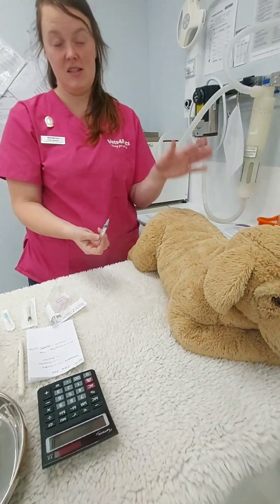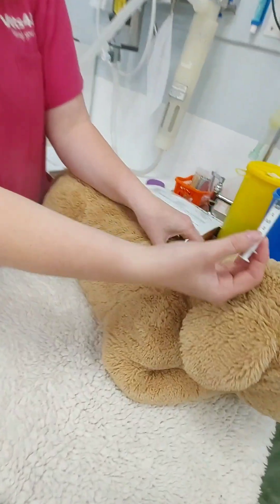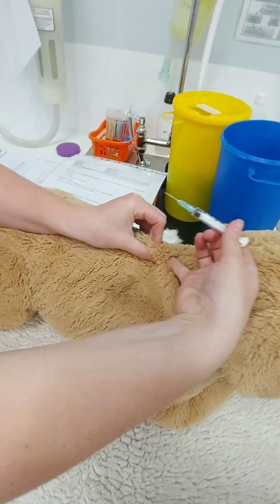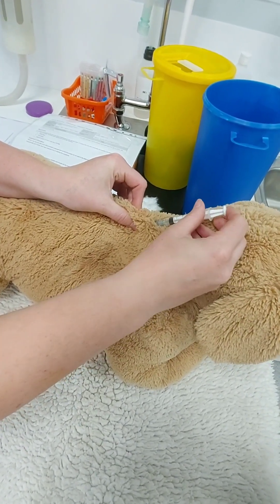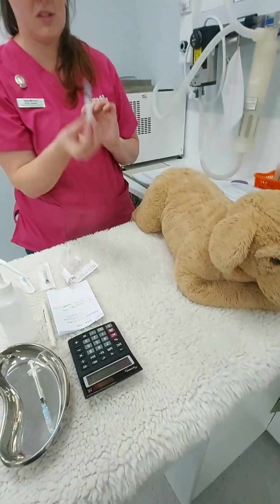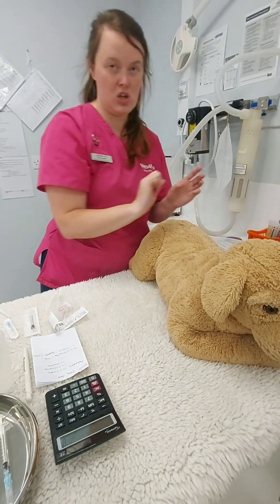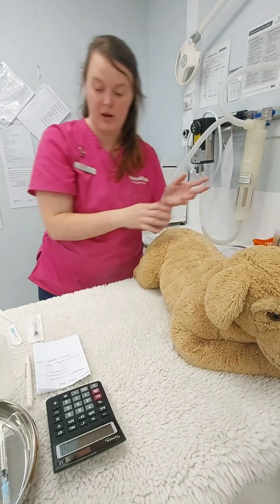For subcutaneous, it's the scruff. Remove your cap, create a tent — it's a bit hard on these practice dogs due to their stitching, so come a bit lower to get a good tent. Come in, inject, draw back and give the medication. Rub at the site afterwards.